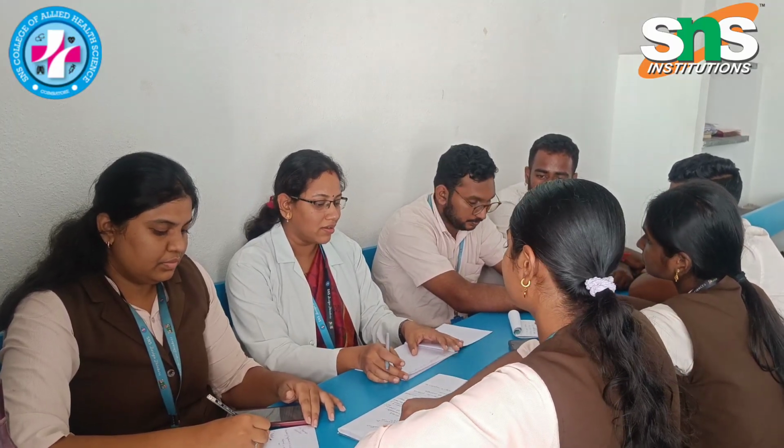Before going for a partial bypass, we will go for a cardiotomy bypass. What does that mean? Using only suction. It's called a suction bypass or cardiotomy bypass. We are taking the suction and we are running bypass. At that time the heart will also be working and pumping. That also comes under partial bypass. What is left heart bypass? Only perfusing blood to the left side of the heart. The perfusion will be taken by the left side of the heart.